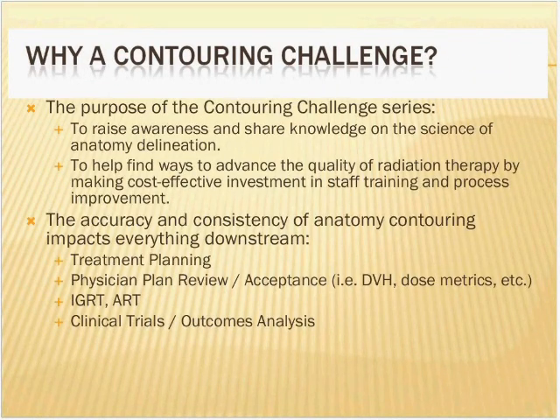So why a contouring challenge? Really, in general, we want to raise awareness, first of all. This is a great way to improve quality in any clinic, in any city, in any part of the world. That is, if we contour better, quality will be better by definition.